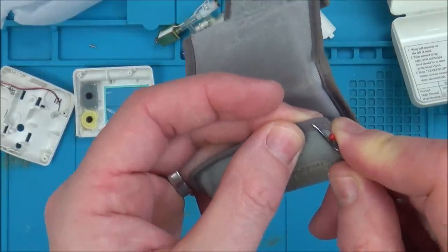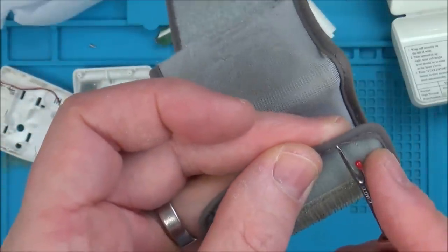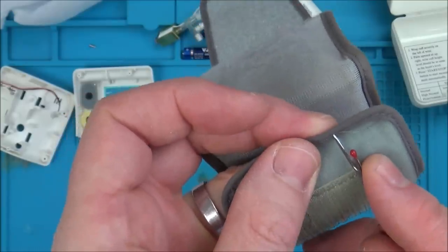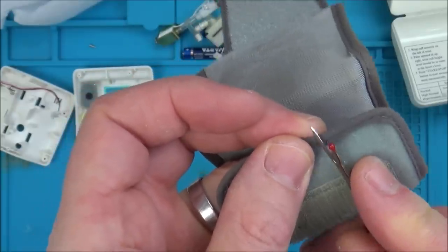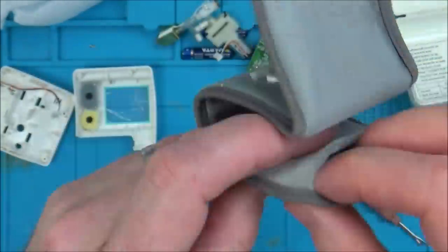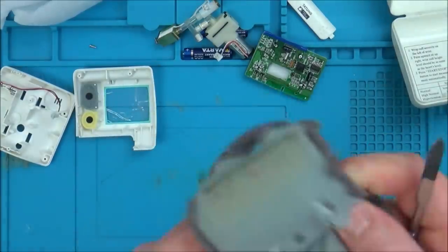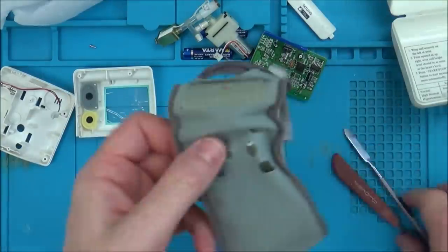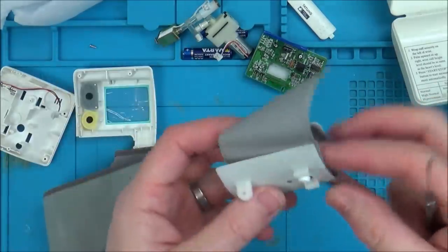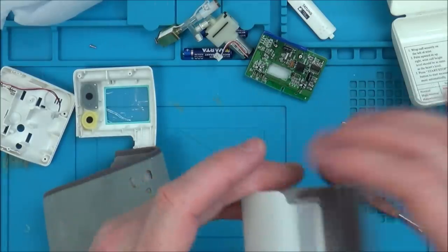I'm just going to start from one side. There you go, just in there like that and it just cuts it. Now because I've cut it, I should be able to just pull them through each one. It'll be interesting to see if this comes out in one go or is it somehow glued on the inside. Excellent, I've got it out. So there's going to be a hole in this somewhere. So can we pull this out completely? Yes, we can.